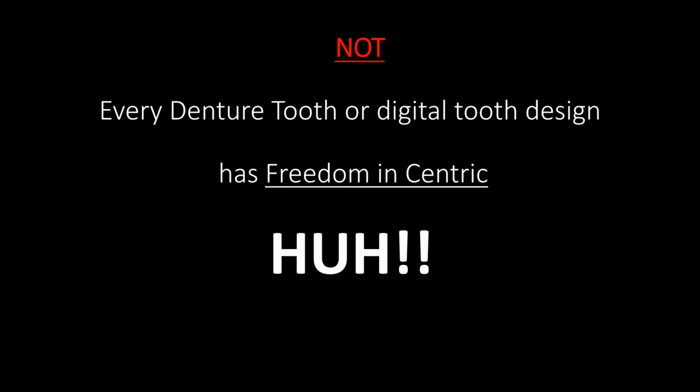It doesn't matter that I set it up that way in the lab. It's not functioning like that in real life. That was my aha moment. I have really cut down on my adjustment rate because of the incorporation of freedom in Centric, and varying degrees of it as I play with it to this day, based on my understanding of the patient.